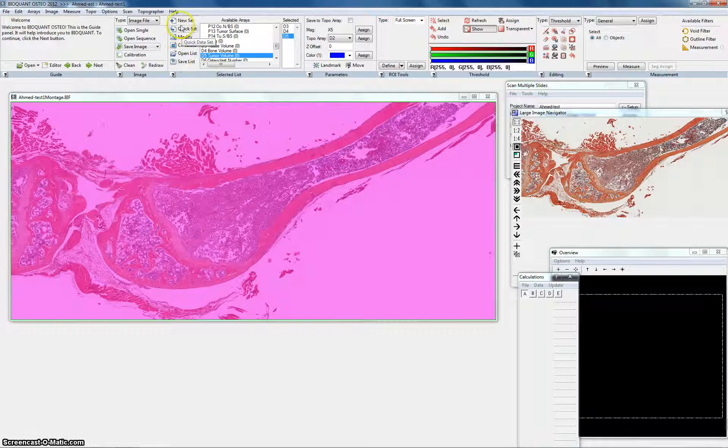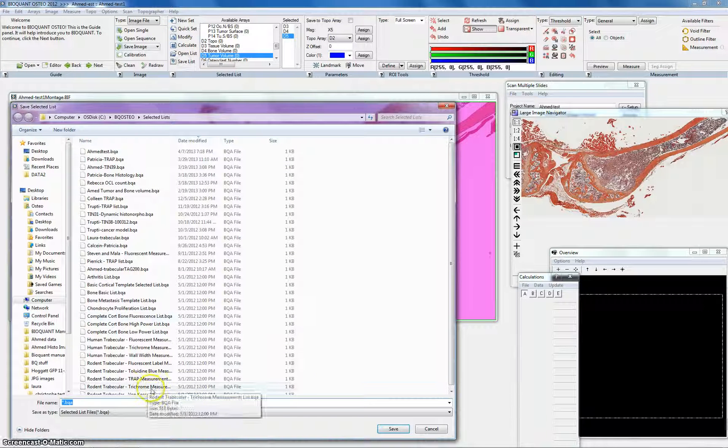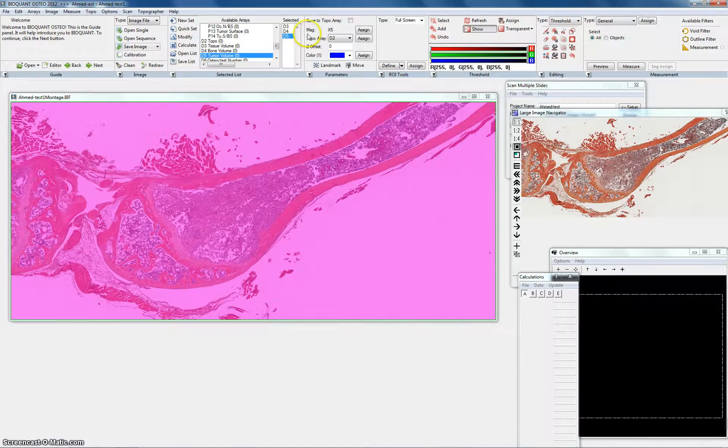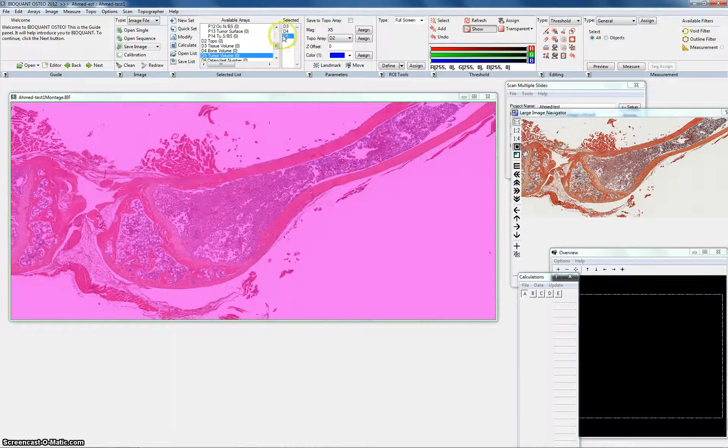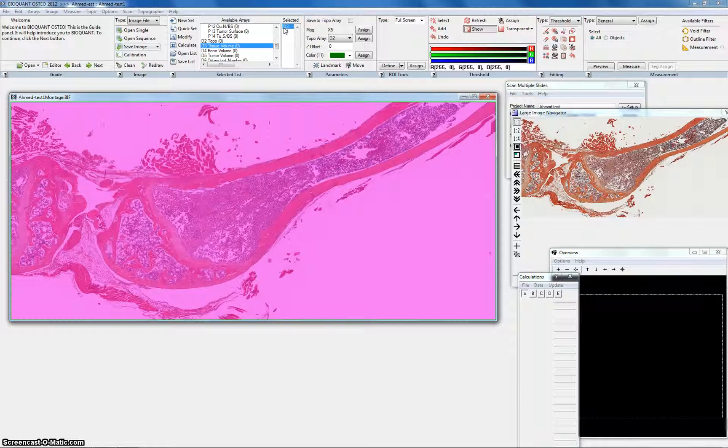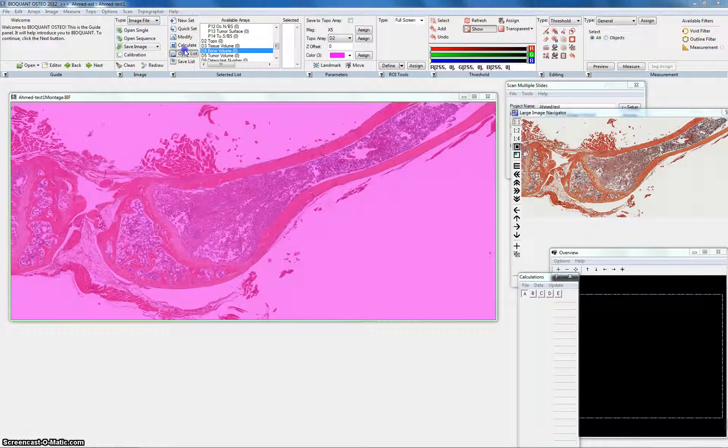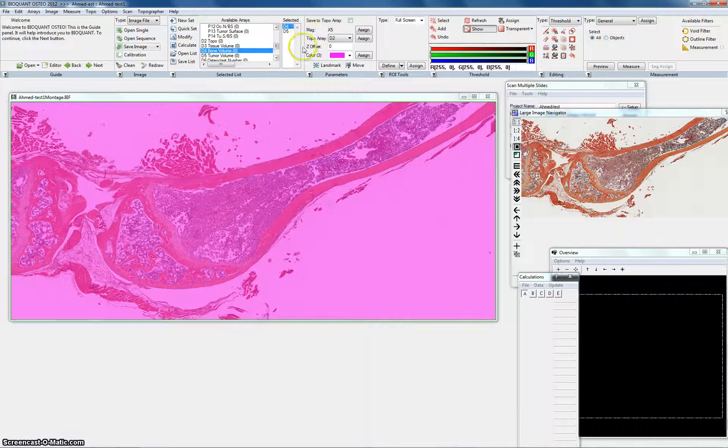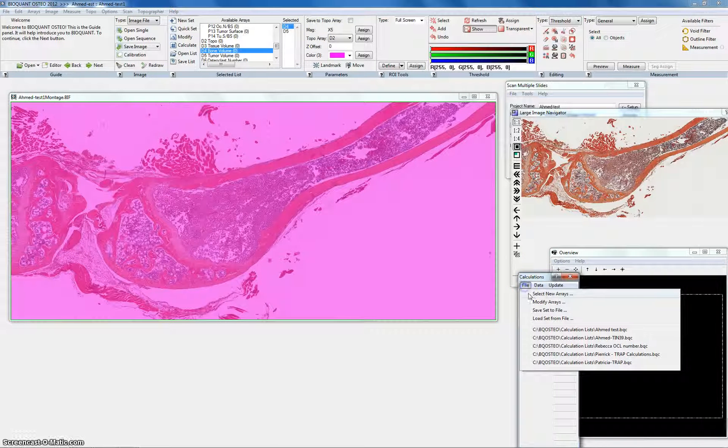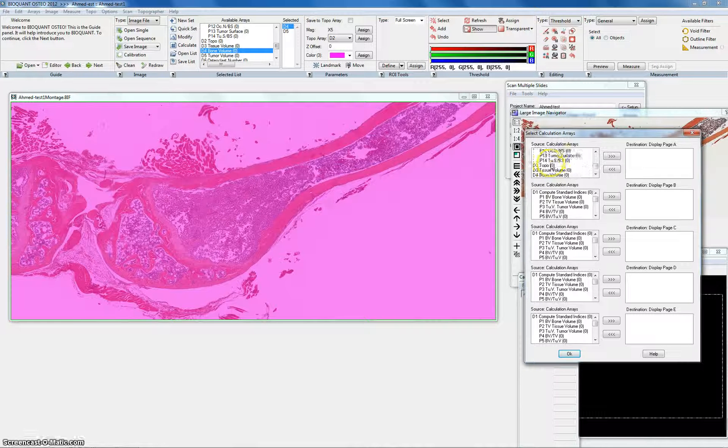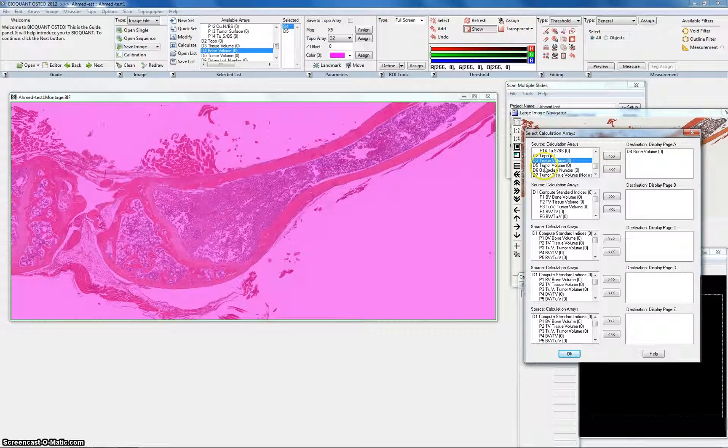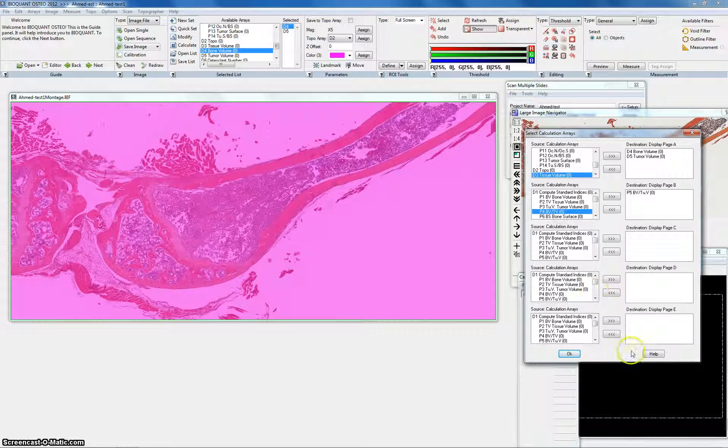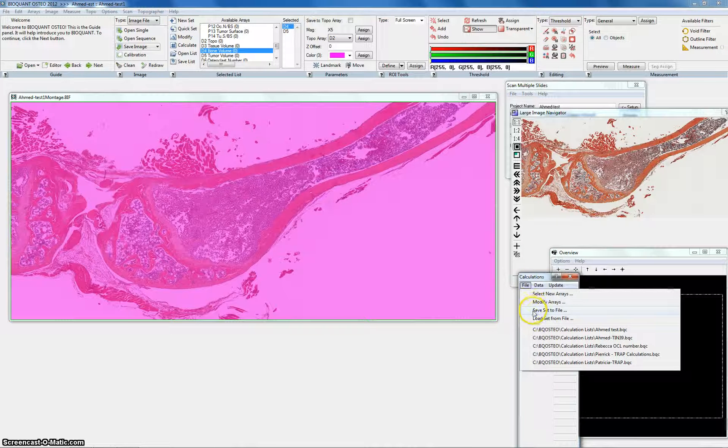You can save this set if you're gonna use it repeatedly over like 50 samples in a row. So you hit save list and then you save it under your name and instead of going back and choosing one by one you just load the list. And the same thing with the calculation box. You could start a new array. So in this array you want to calculate the bone volume and the tumor volume for instance and the equation for the BV per tumor volume. And then you could again save it and then for the next time just load it.